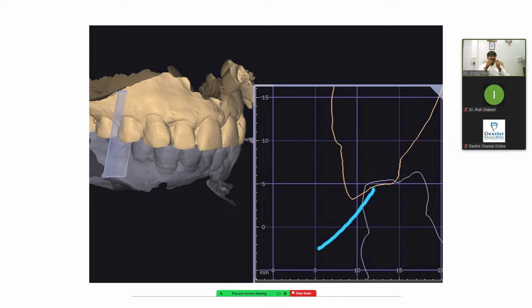So once you scan your occlusion, you check your scan files from the back side to see it's not going through. How to modify it? You cross that bite and start rescanning the bite, and you place one hand on the masseter of the patient and ask the patient to intentionally clench before you start scanning. The patient clenches and then you say relax. Now you feel the muscle is relaxed.